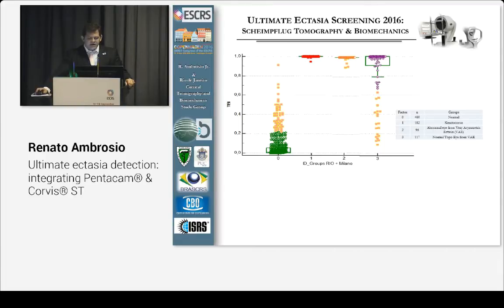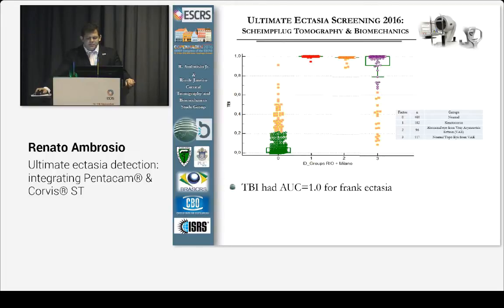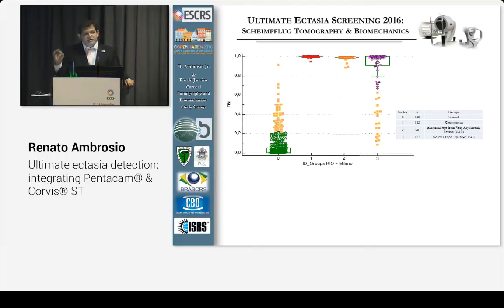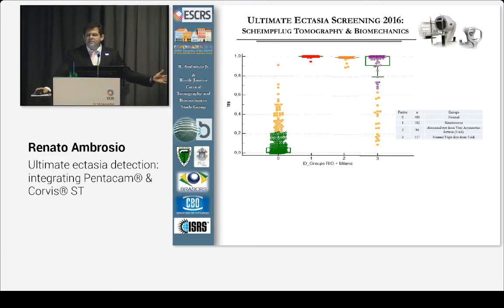The normals and ectasia cases are very well separated, giving 100% sensitivity and specificity to detect frank disease. A few outliers exist because those are ectasia eyes from patients who may have truly unilateral ectasia, which behaves somewhat differently. For the forme fruste cases — the topographically normal eyes — you have 90% sensitivity with still very good specificity. You say yes in patients who may have risk, and no when the patient does not have risk. Here, fewer than 5% are false positives, a huge enhancement — sensitivity rises from 70-80% to 90%, and specificity also improves dramatically.